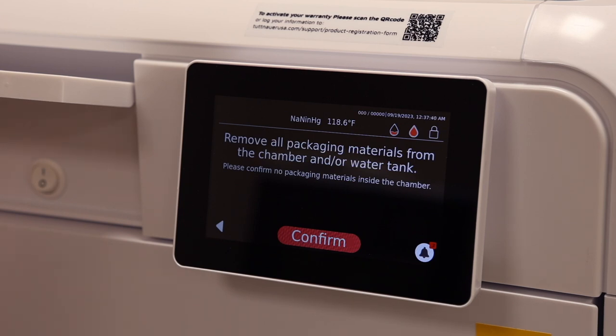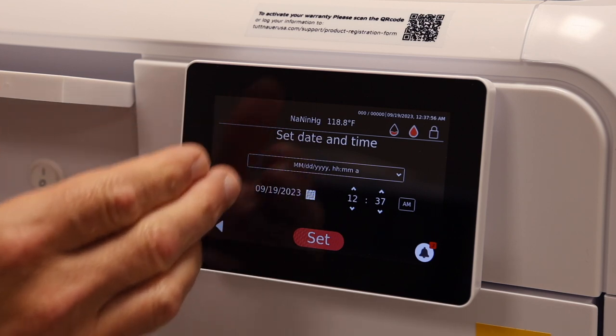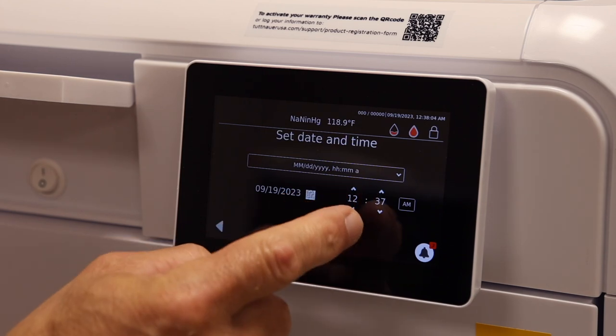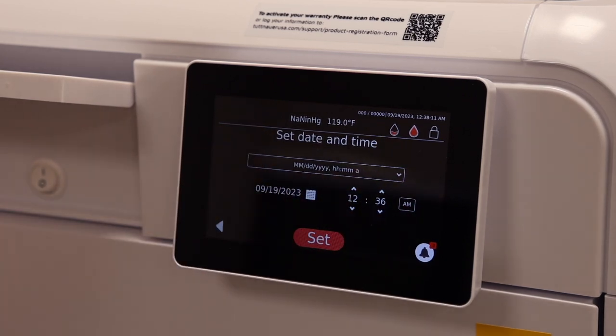It will remind you to remove all of the contents and packaging material from the chamber and the reservoir. Make sure you remove all of those contents, then hit the Confirm button. It asks you to set the date and time. The unit will automatically pick up the date and time in military time, and you just set it up or down to your local time.